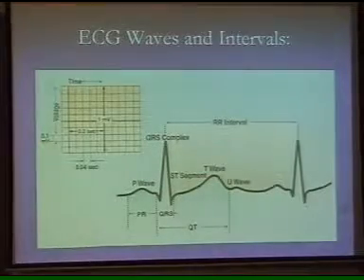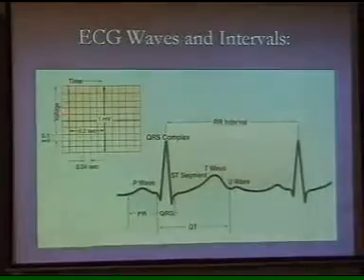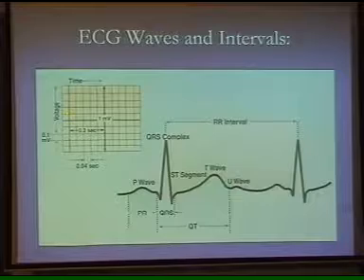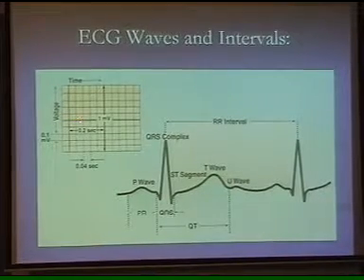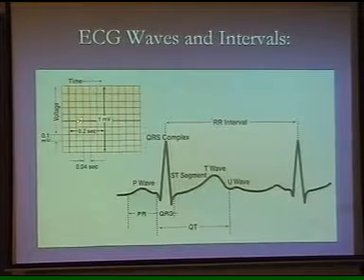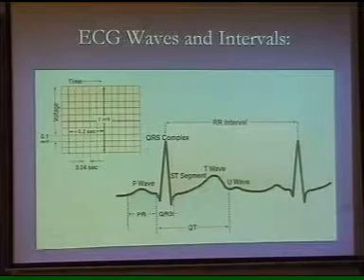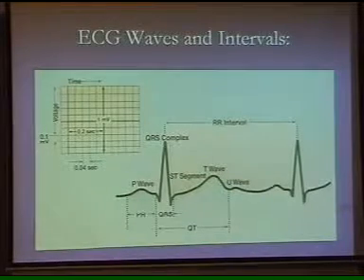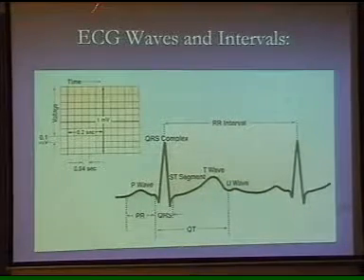Similarly, the amplitude of the small square is 1 millimeter across, 1 millimeter up and 1 millimeter across this way, on the y-axis and the x-axis. So one small square is basically 1 millimeter squared, right? It's just a very basic thing. You'll come to the significance of that.